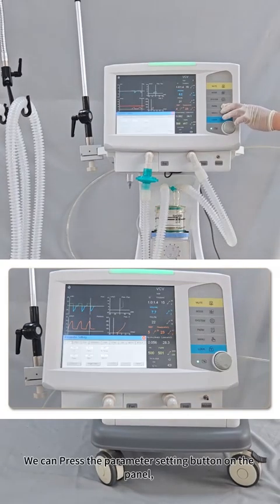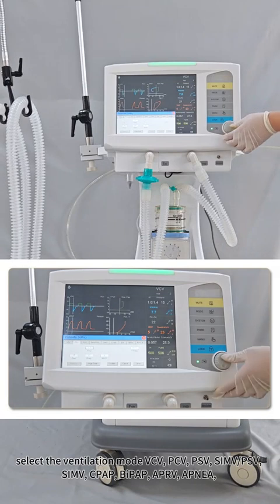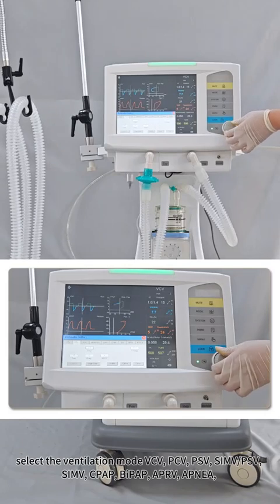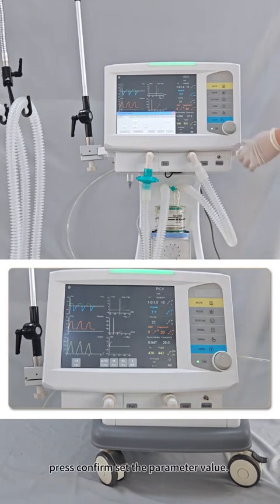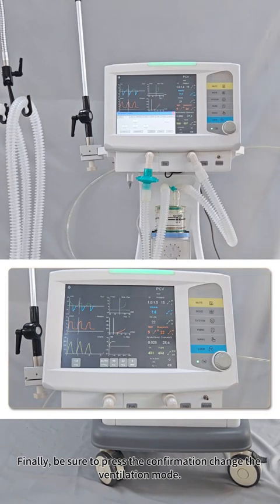We can press the parameter setting button on the panel, select the ventilation mode VCV, PCV, PSV, SIMV/PSV, SIMV, CPAP, BiPAP, APRV, apnea, press Confirm, set the parameter value. Finally, be sure to press the confirmation to change the ventilation mode.